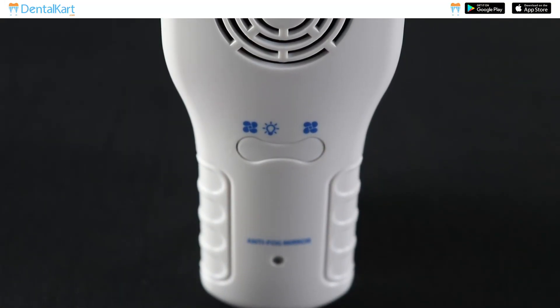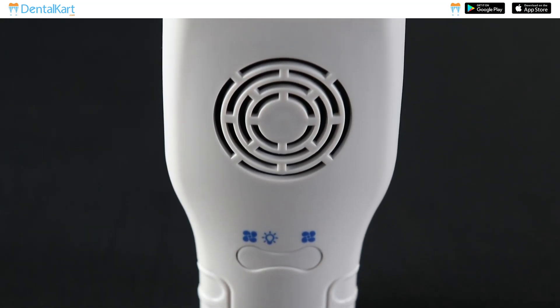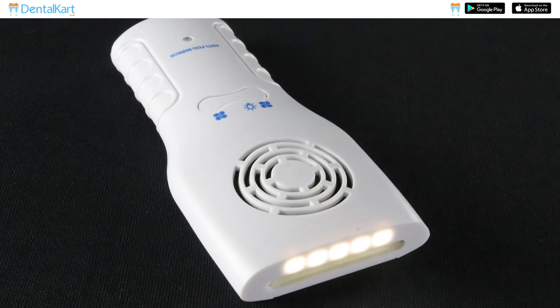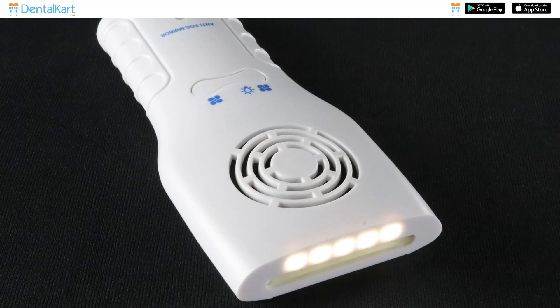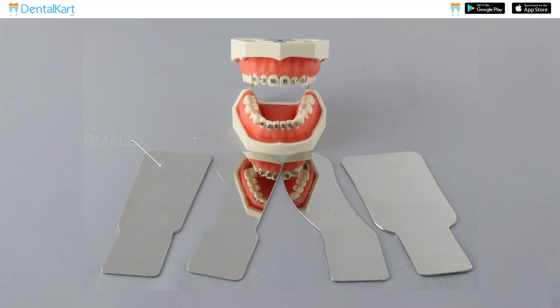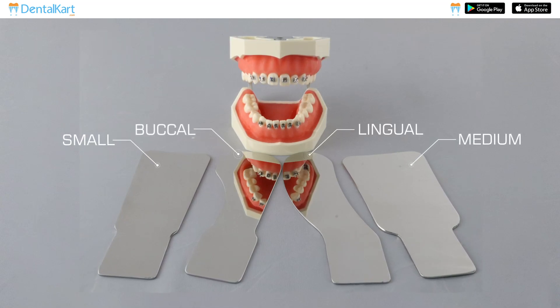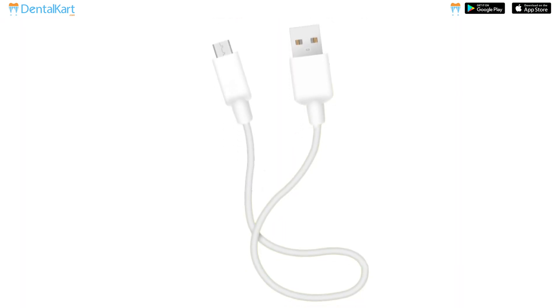The UU Ortho Dental Photography Mirror Kit comes with a micro fan in the base for preventing fogging and 5 LED lights for better illumination. It includes interchangeable highly polished stainless steel mirrors: two occlusal mirrors, one small and one medium size mirror, one buccal mirror, one lingual mirror, and also comes with a charger.